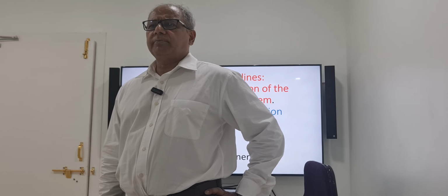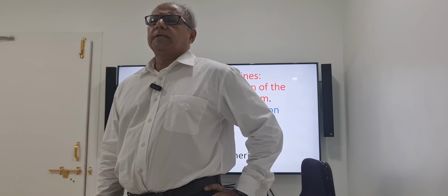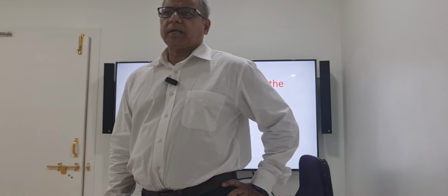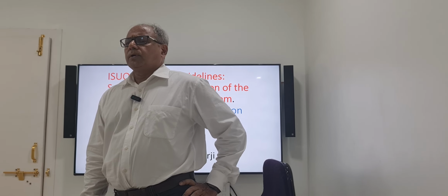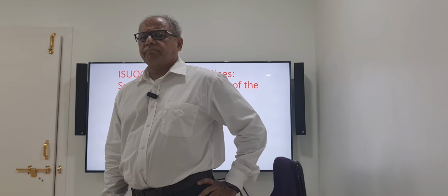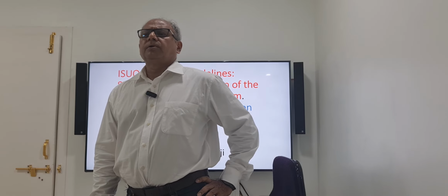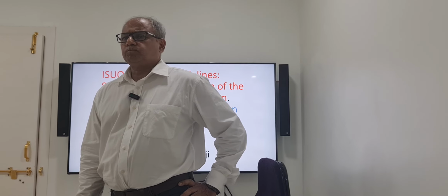I left this out in a previous journal club because it was a third topic and a big topic, and I promised that I will cover it later on. This is a very important topic today, which I found: during ultrasound of the baby, how to see the fetal neurological system, the brain and the spine.